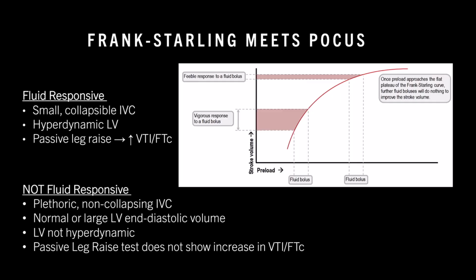Some findings on ultrasound that are more consistent with likely being fluid responsive would be things like a small collapsible IVC, probably a hyperdynamic left ventricle, and what we'll be focusing on today, how a passive leg raise will increase a VTI and carotid flow time. Findings that are suggestive of non-responsiveness would be plethoric, non-collapsing IVC, a normal or large left ventricular end diastolic volume, left ventricle that is likely not hyperdynamic, and again, how a passive leg raise test, conversely, would not show an increase in VTI or carotid flow time.